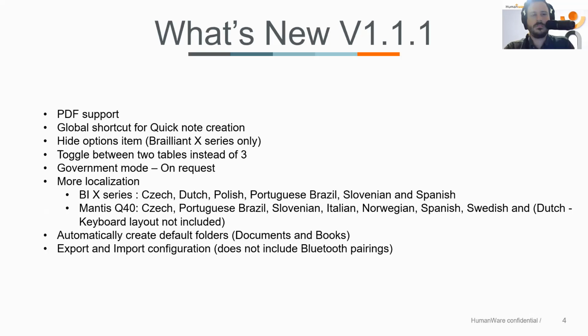If it's, of course, a picture PDF, then you will get notified with an error message, or it will say that it cannot be opened. So it has to be a true text PDF file, and it will strip down the text and put that in a linear fashion. So there'll be no formatting that it will bring over.